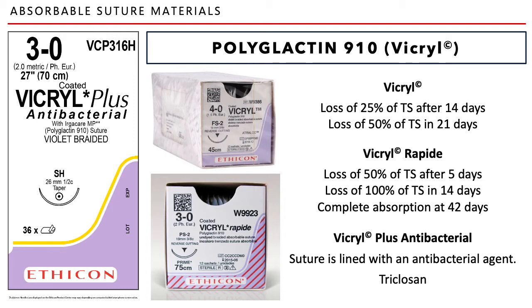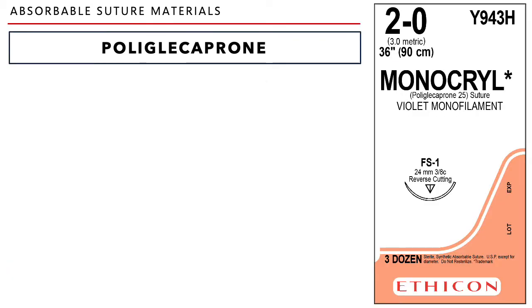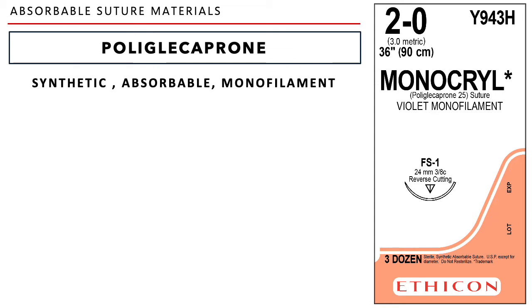Either polyglactin or catgut. Later, we'll discuss silk and nylon. Basically, that's it. Poliglecaprone is actually a very common suture material in other countries. Okay, I don't know, in developed countries. They don't use catgut anymore. They rejected that. So Monocryl is one good thing they have. Synthetic, absorbable, and it is monofilament. As compared to Vicryl, which has more drag, which is easy to handle, but if you want a monofilament, if that is what is indicated in your surgery, then Monocryl is the way to go.